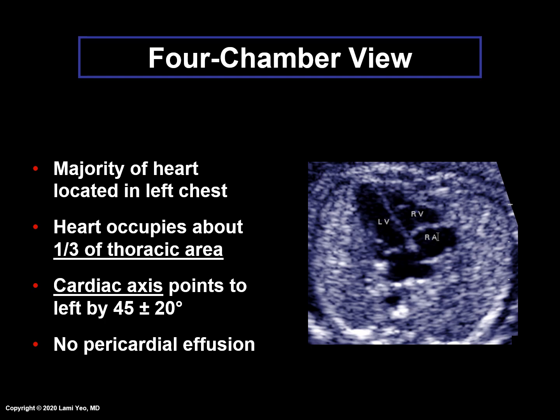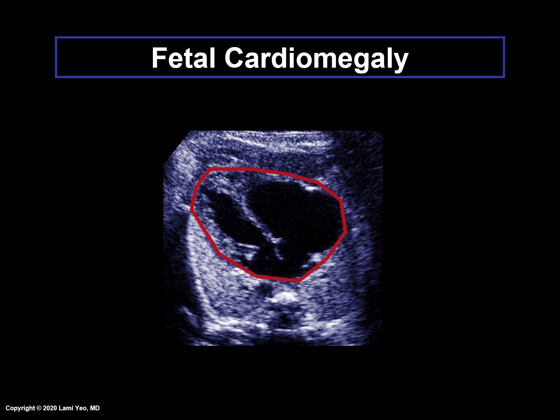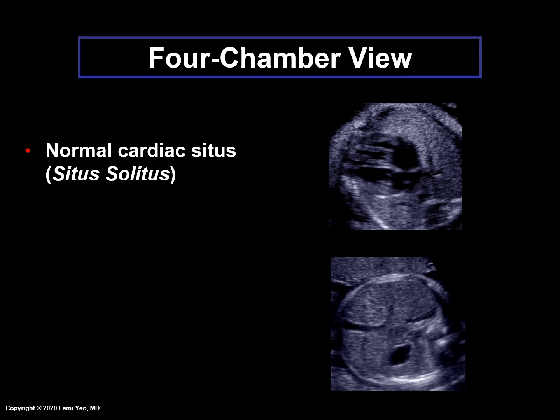Finally, there should be no pericardial effusion. Here is an example of fetal cardiomegaly in which the outline of the heart clearly is larger than each of the lung fields.